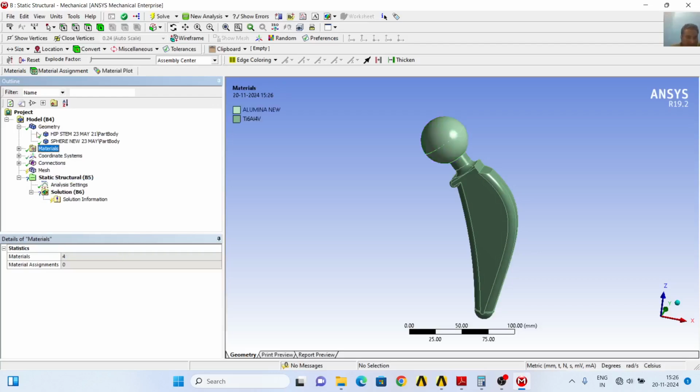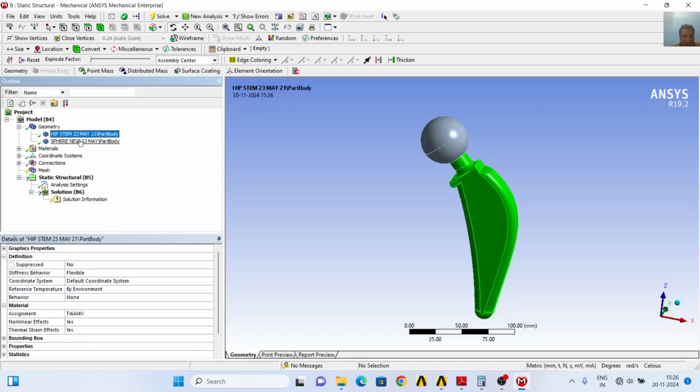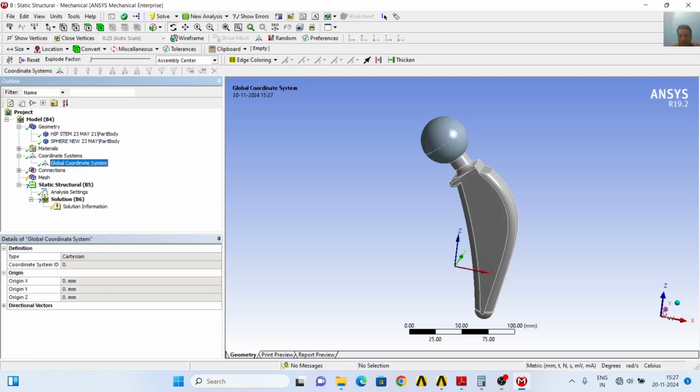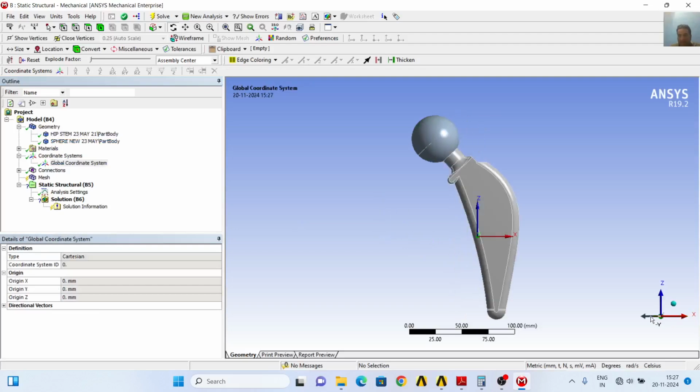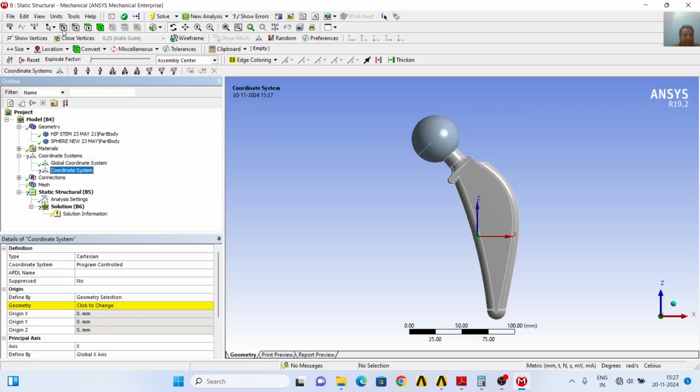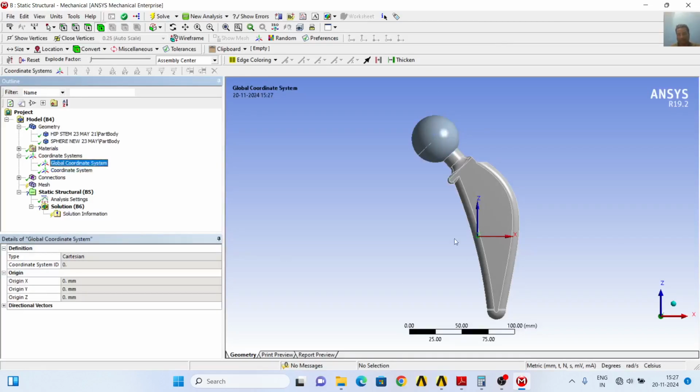We will minimize this, and you know the geometry very well. This is the hip stem, and this is the sphere, and we will create an additional coordinate system here. This is the global coordinate system, and we need to apply the loading force to the head. So we need to create an additional coordinate system here, and we will click this head geometry to create it. This coordinate system has the values of x, y and z here. You can see that the global coordinate system is here. So we will apply the forces on the new coordinate system.